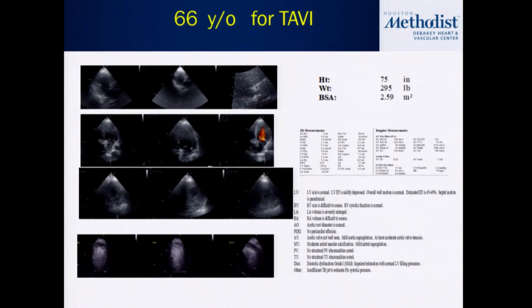It would be very hard, if the patient after TAVR, to decide if the EF improved by 5% or 10%, right? I mean, it's not easy. Obviously, ideally, you can have a patient get an MRI before and after, but not always possible. It's very expensive, but since everybody gets a CT, for instance.